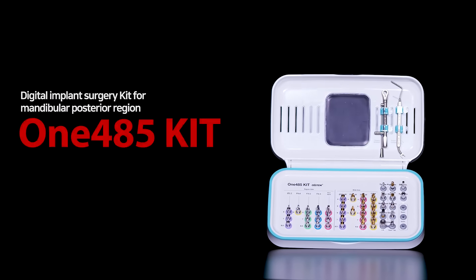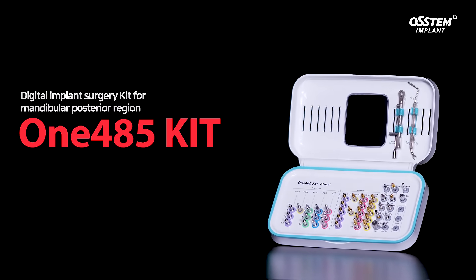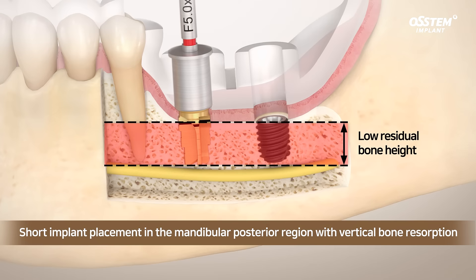Introducing the One485 KIT, the implant surgery kit for a mandibular posterior region. The One485 KIT is used for implant surgery in the mandibular posterior region with vertical bone resorption.